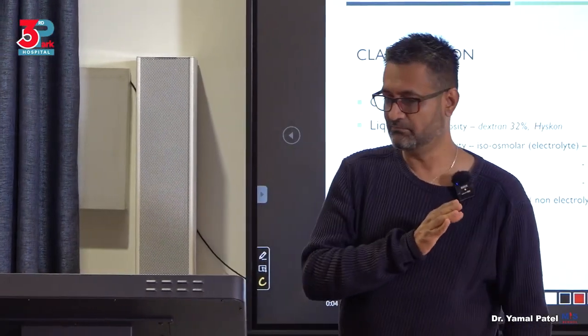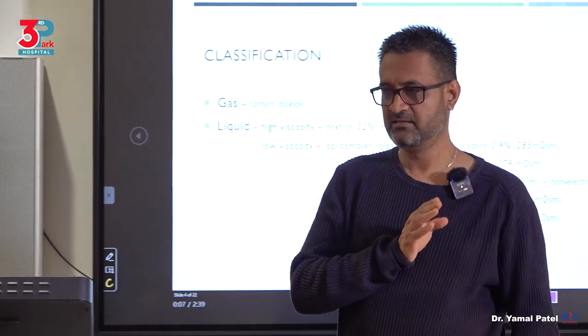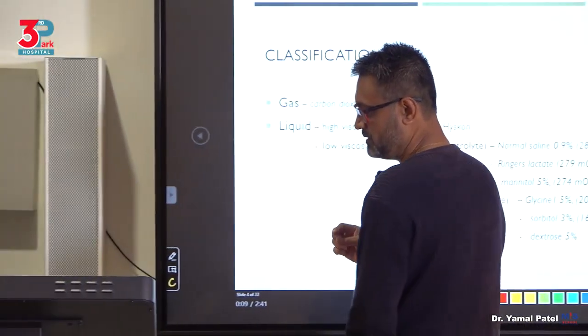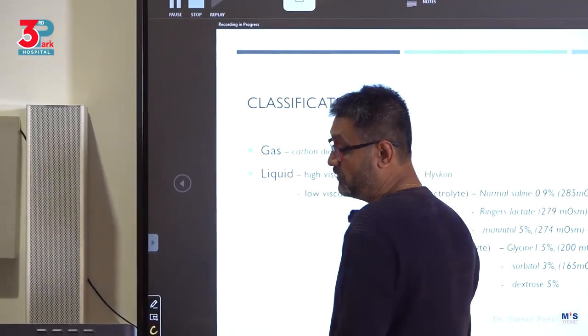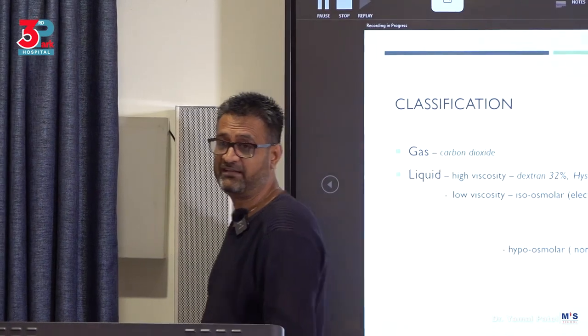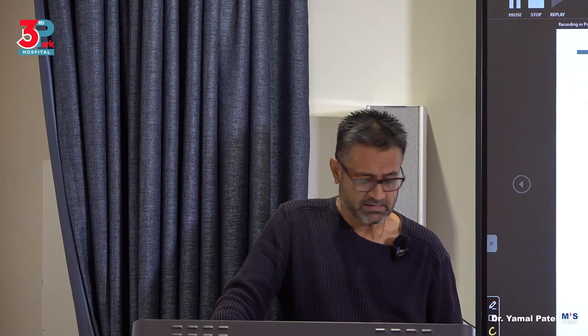So we divide media into two types broadly. One is gas media and liquid media. Gas media has been used in the past in the form of CO2 gas, mainly for diagnostic procedures. It's difficult to operate in the gas. Okay? So these days we do not use it. It is of theoretical knowledge that you need to know, but we don't use it anymore. So we go down quickly to liquid.